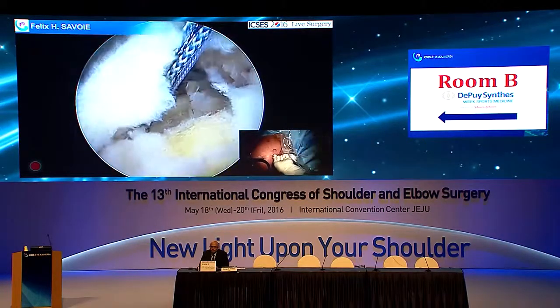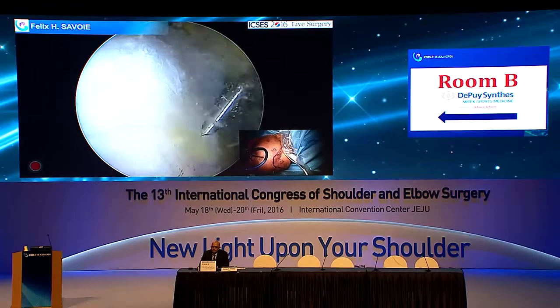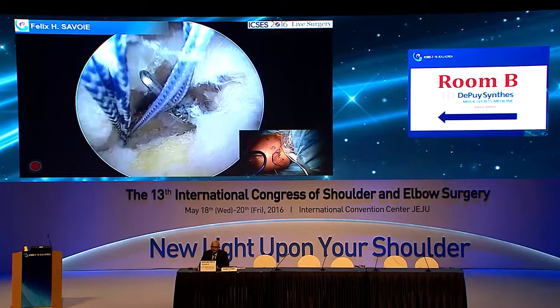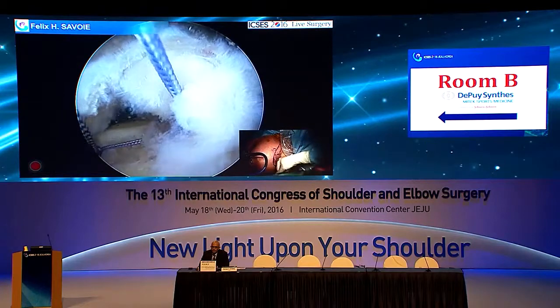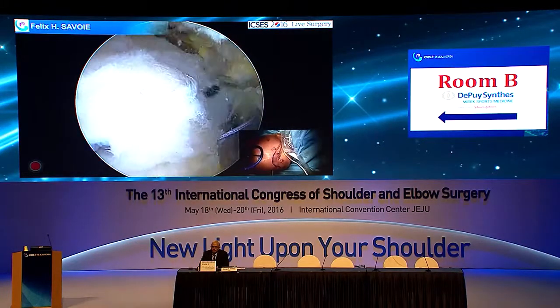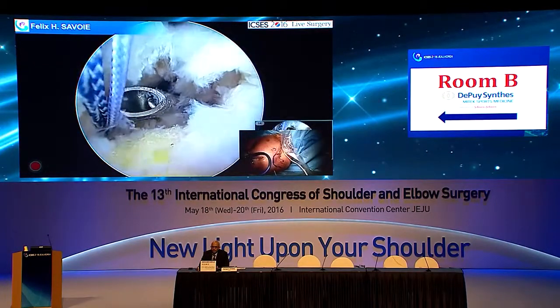And so there's our sutures. So now we'll come in back here, and we've already checked to make sure that we can pass from back here. So we'll start, and if you look at it, we'll need one kind of mid-infraspinatus here, medial to that tear. And we'll make sure that we don't offload our anchor. And then we'll do a second one coming around the corner. So if you think of this as a big ellipse, we're just trying to keep moving around. So we kind of take this and drop into the joint, come over. This is the one we want that matches that one.